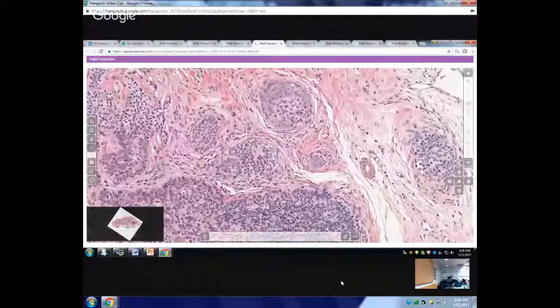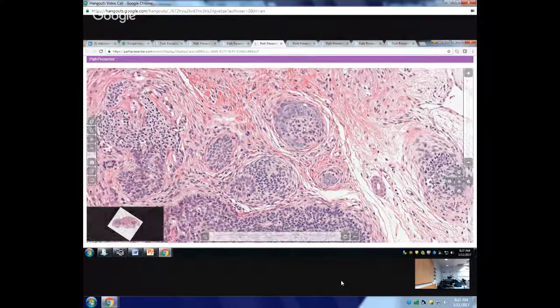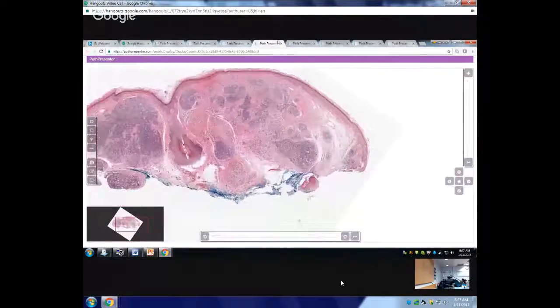What is the papillary mesenchymal body? It is a semi-lunar, moon-shaped basaloid proliferation with dermis going inside it. That is known as the papillary mesenchymal body, and it recapitulates the lower part of the hair bulb. This is the lower part of the hair bulb, where this is the basaloid part, and this is the dermis going inside the lower part of the hair bulb. Is that okay? Yeah. Okay.